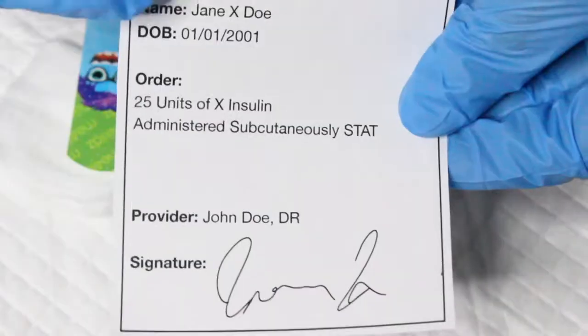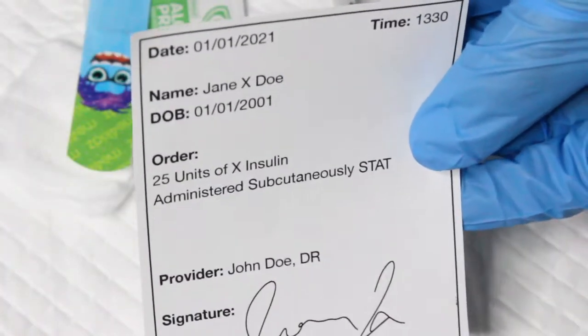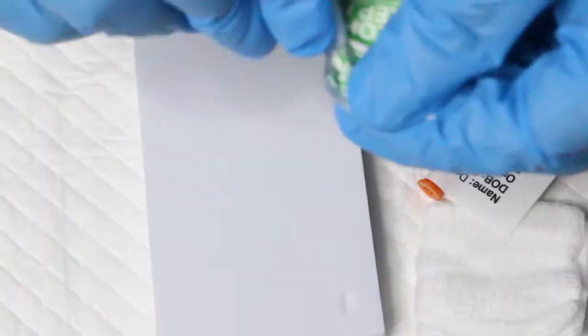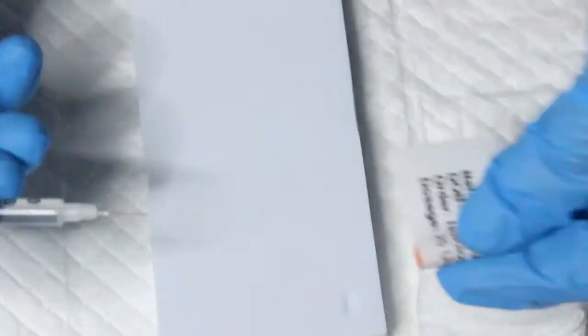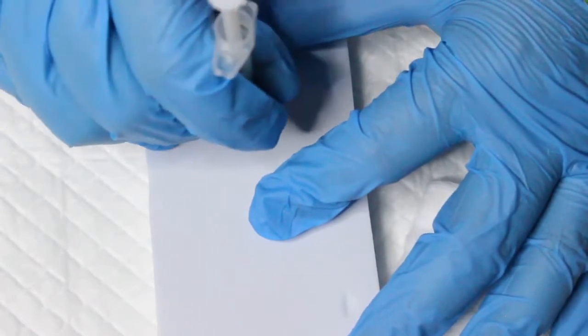Once you are in the same room as the patient, verify you have the correct patient and medication. This is also when you would hand the patient a VIS sheet from the CDC if it is an immunization. Next, you can begin prepping the skin to administer the injection by locating the proper injection site, cleaning the area with an alcohol swab, and then allowing it to dry. Now you can squeeze up on the skin around the injection site, insert the needle, administer the injection, and allow the needle to remain in the injection site for 5 to 10 seconds.